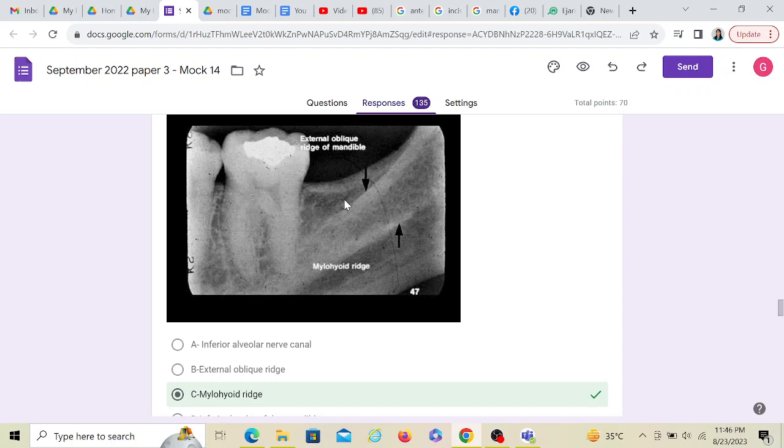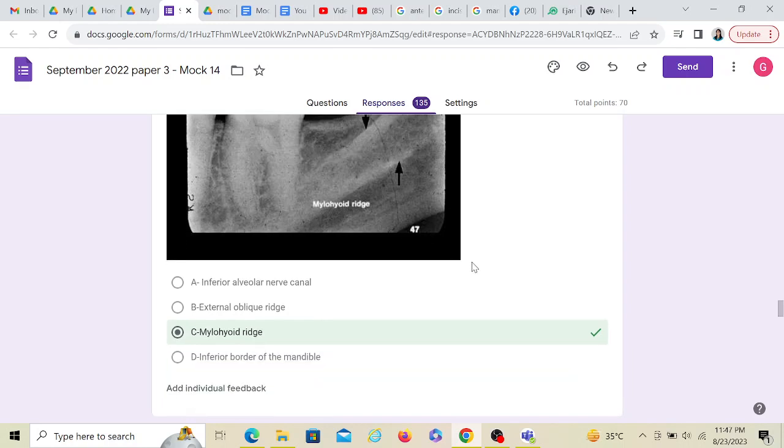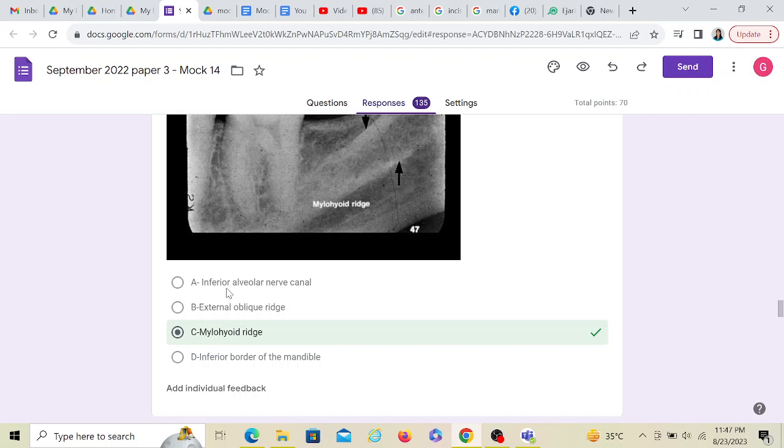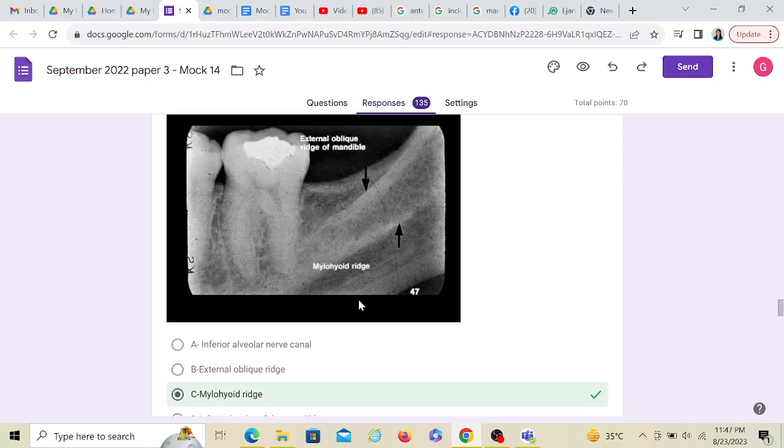You know where to insert your needle in inferior alveolar canal blocks, so you're expected to know these landmarks. If you don't, it's okay - just go ahead, Google, learn, remember the image, try not to make a mistake in these questions please. Even if you are not sure, you can still solve the question by elimination of the other options. Like, if this arrow was there and I'm not sure what this is, I definitely know it's not inferior border of mandible because it would be here. I definitely know it's not a canal because canal is a radiolucent space. I may have been confused between external oblique ridge and the mylohyoid ridge, but I know the external oblique ridge would finally go towards the external surface of the mandible, and the mylohyoid muscle attachment is here.